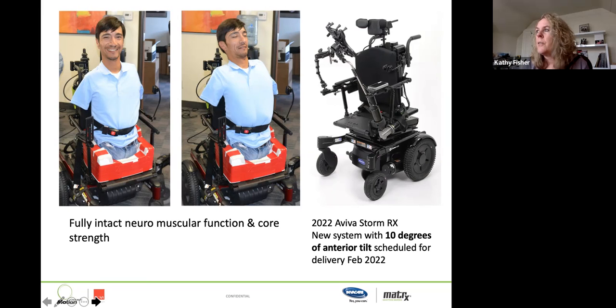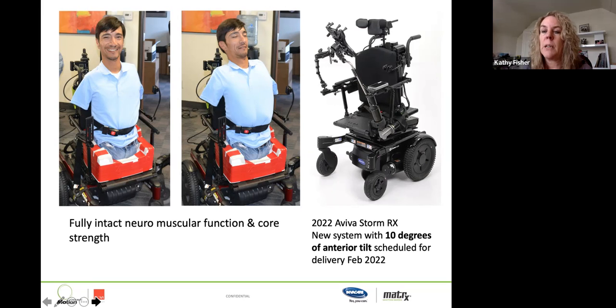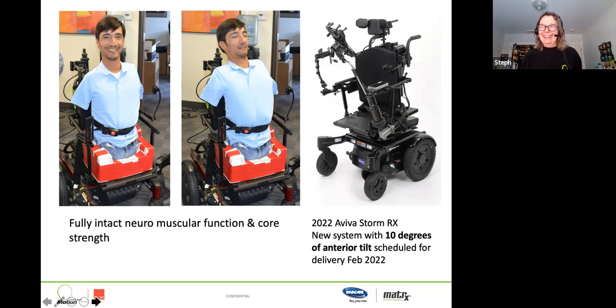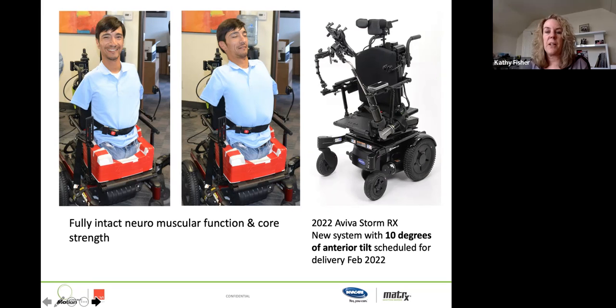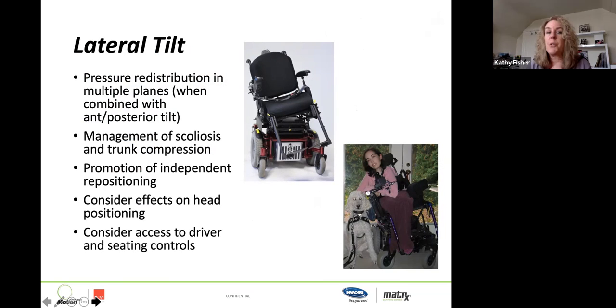Yeah, we learn with kids with cerebral palsy that a little bit of anterior tilt can't stay there all day, but it really gets that extension going and changes their position. And absolutely, I know for me, sitting at home, working all day long, it sure makes a difference when you can have a little bit of anterior and posterior tilt in your chair to sit all day. And we're able-bodied. Exactly.